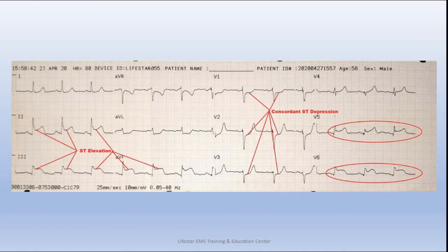But the cool part is this middle part here, where you have the pacer firing again when it's not firing in leads 1, 2, 3, aVR, aVL, aVF, and 4, 5, and 6. No pacer spikes there. The pacer's only firing in that middle segment. So this is literally giving you a snapshot of what pacing does in order to hide STEMI. You have a patient 18 minutes prior.